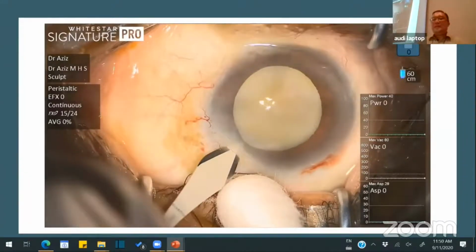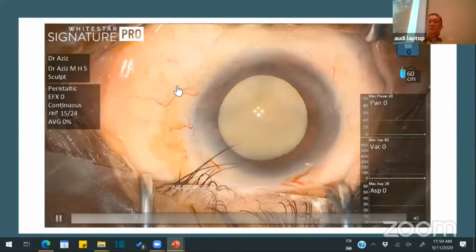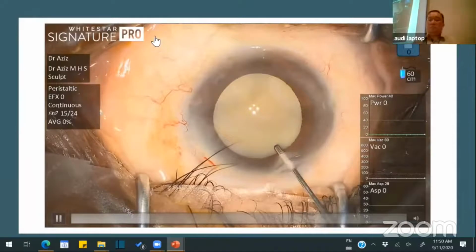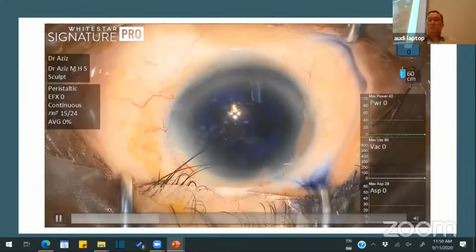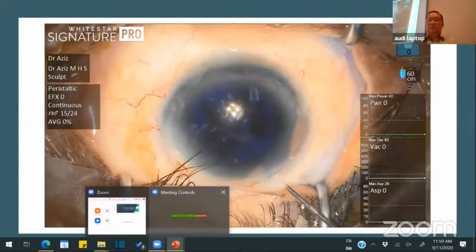Little, right? You just slide it in. So it's done. So you put vision blue. You wash it out, okay.